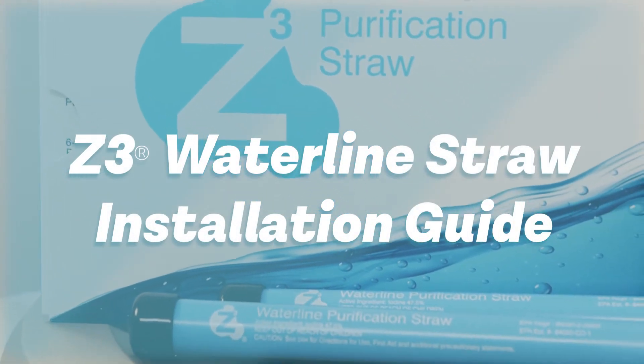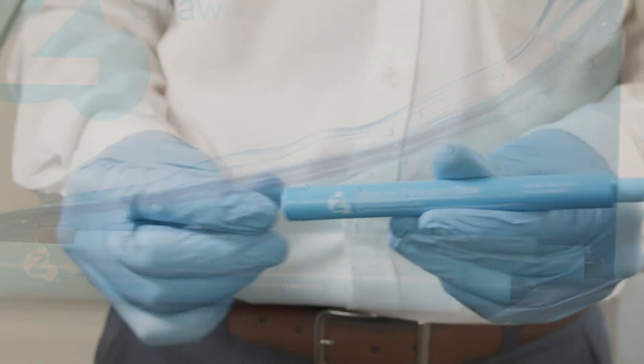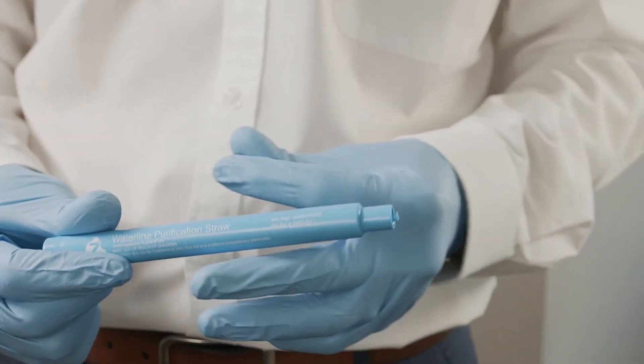The Z3 straw is easy to install and easy to maintain. When you receive your Z3 straw, start by removing the vinyl shipping caps from both ends of the straw.